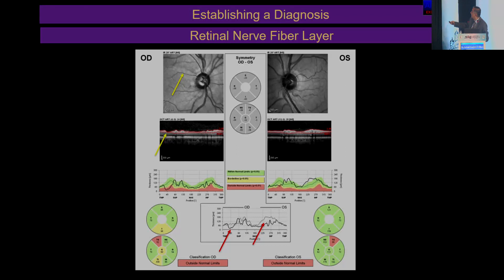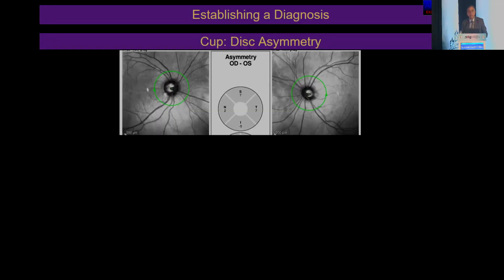We can also see the nerve fiber layer defect on the red-free image. We can see the loss of tissue here. And last, we come to the normative database. We have been used to looking at cup-to-disc asymmetry, and when we look at the cup-to-disc asymmetry, we realize there is a significant difference between these two eyes. But remember that the OCT printout is the only modality that eliminates the presence of the nose between the two eyes.